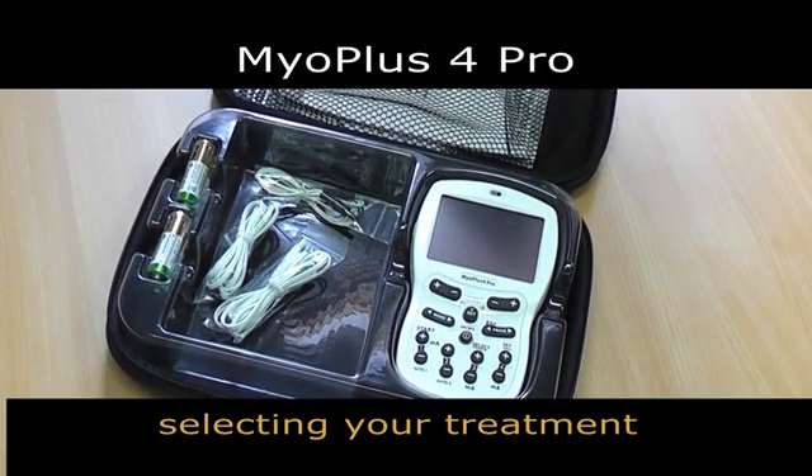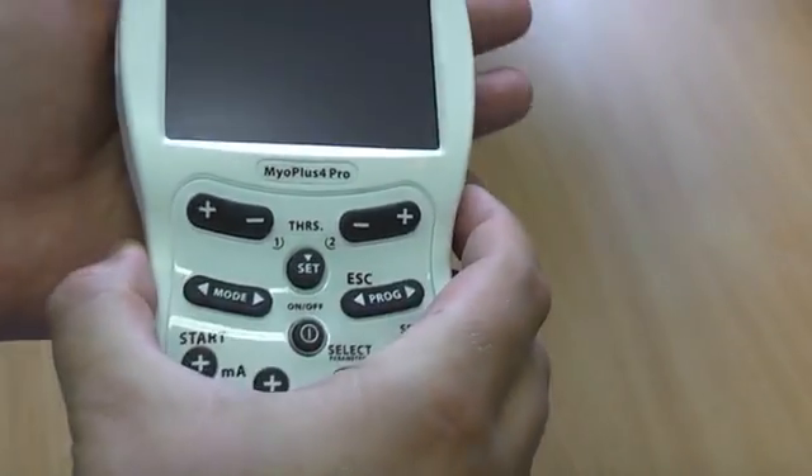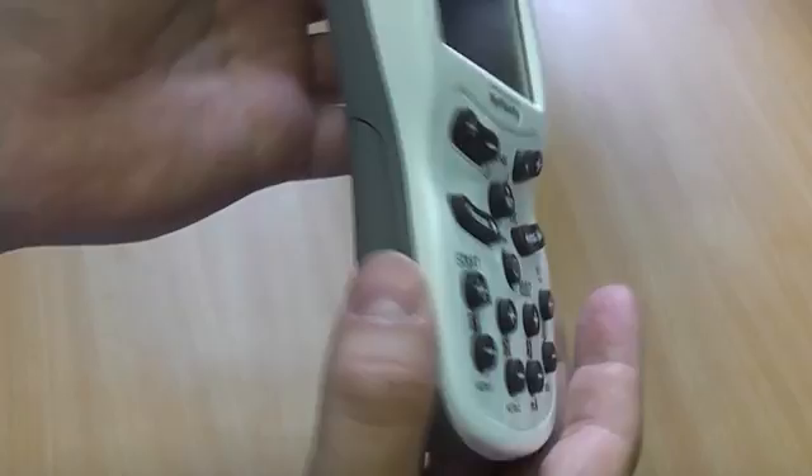In this video we will show you where to start and how to select your treatment program. This EMG triggered stimulation unit, or ETS unit, either measures muscular activity or stimulates the muscles.